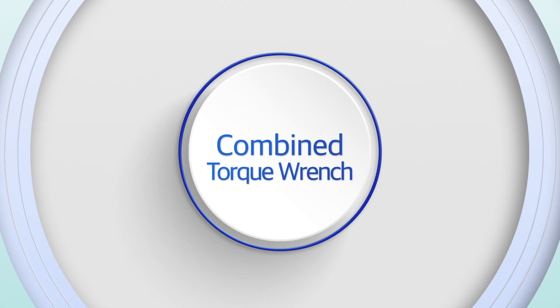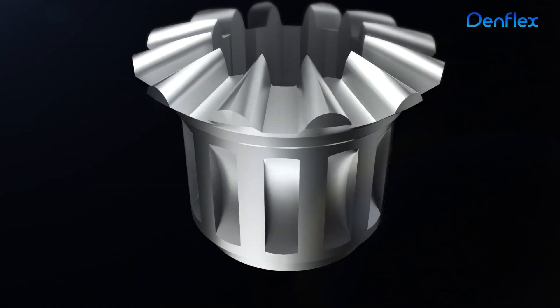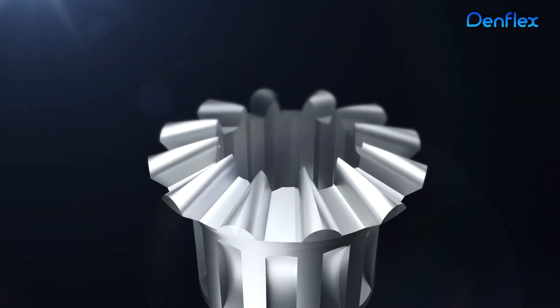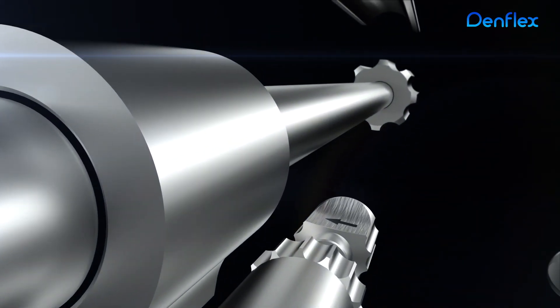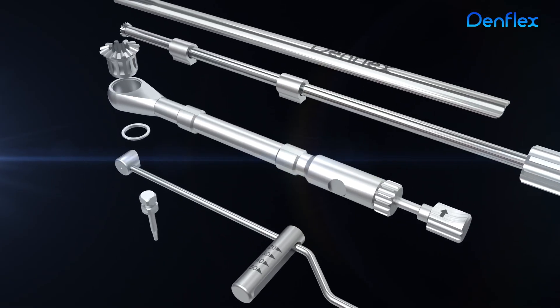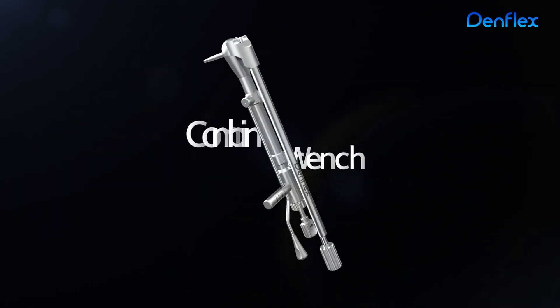Combined Torque Wrench. DenFlex's Combined Torque Wrench — its easier and safer usage reflects DenFlex's technological innovativeness.